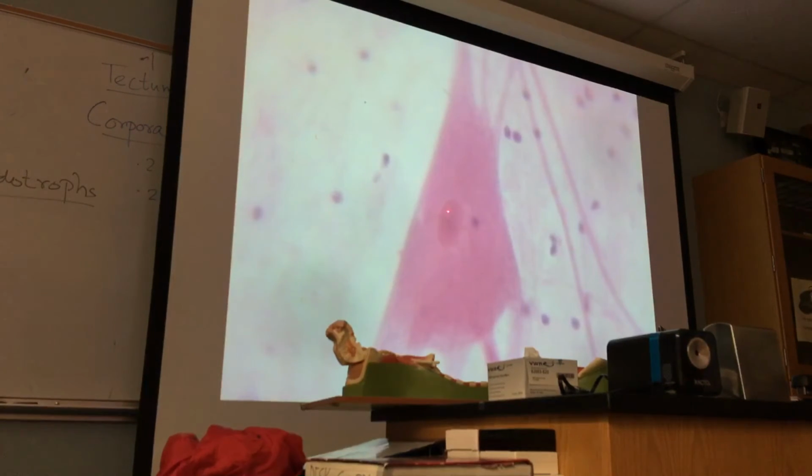Okay? And also, you should know as a student of biology, that if I ask you to identify the structure, then you say the nucleus. Okay? And if you want to be more specific, nucleus of a neuron. God bless you. If I ask you to identify the cell, what are you going to do? Neuroglia or neuroglial cell? Neuroglia or glial cell or neuroglial cell?